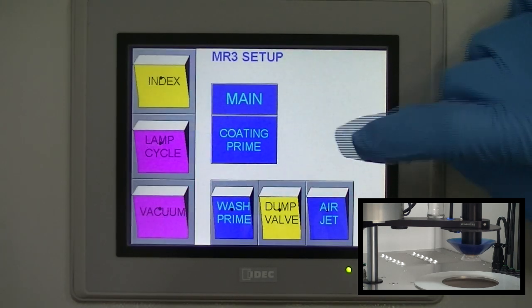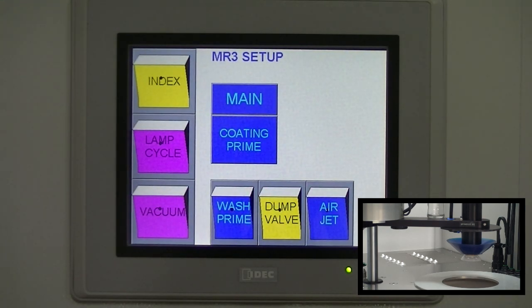Starting at the main menu, press machine setup. Press vacuum button.